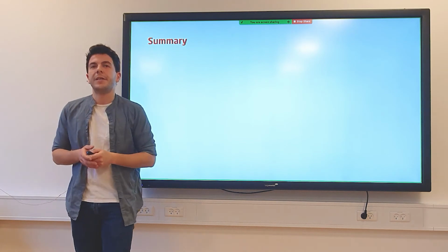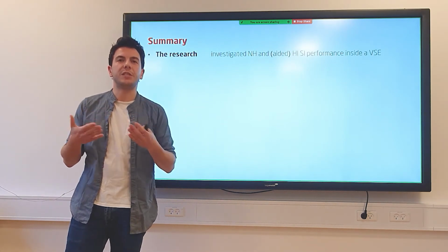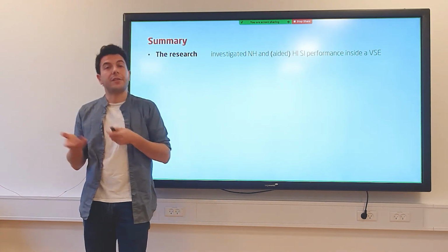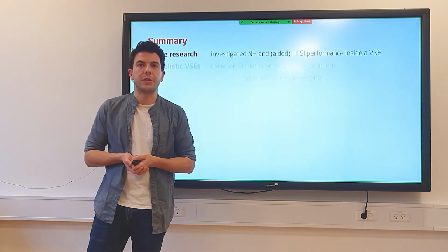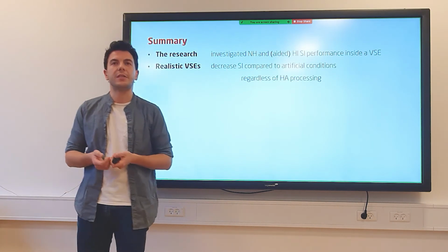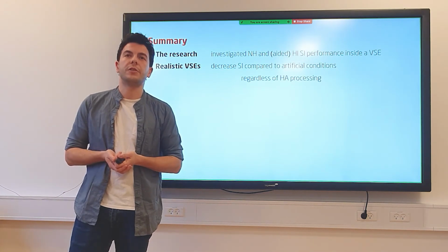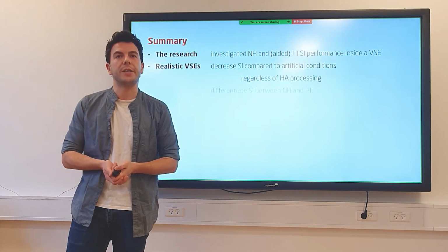So to sum up, my research tries to look at how we can investigate speech intelligibility for normal hearing and unaided and aided hearing impaired people inside various types of virtual sound environments. And we saw that realistic VSEs generally decrease speech intelligibility compared to more artificial conditions, regardless of which type of hearing aid processing is applied.